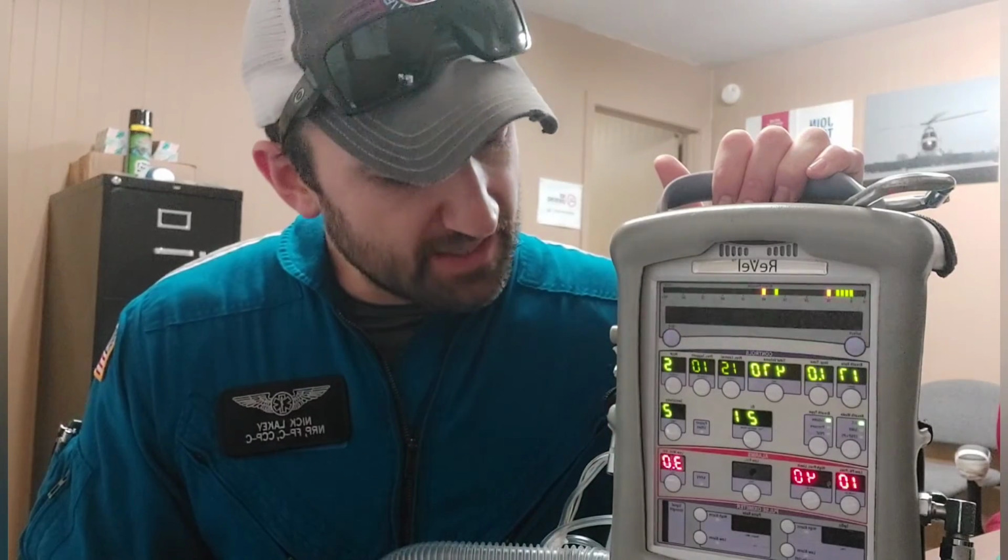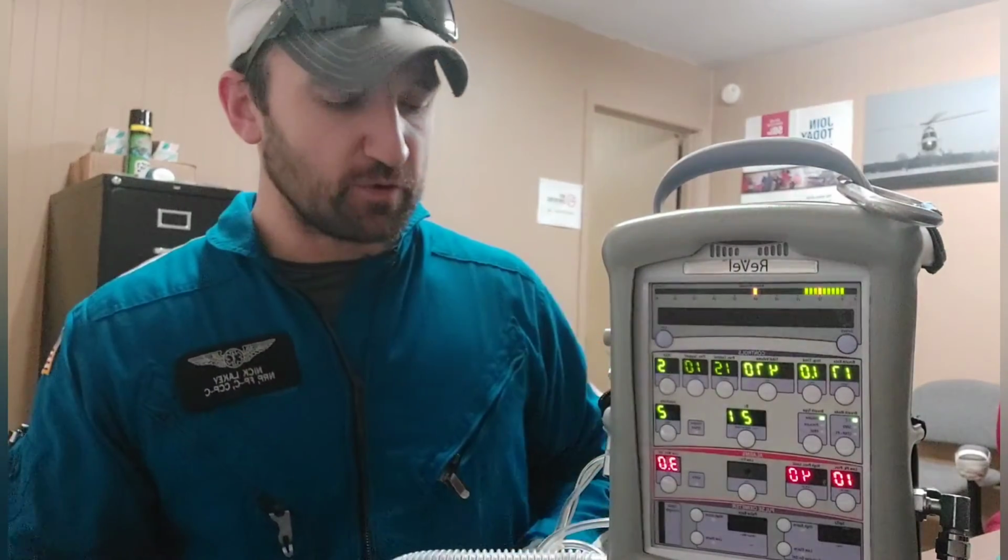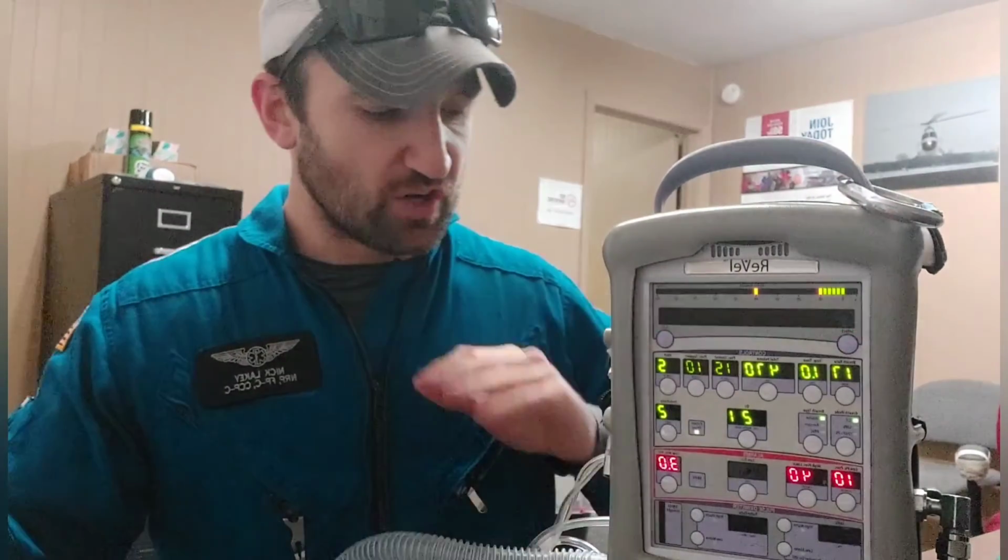So we'd check that circuit, we'd go to the ET tube, we'd check that ET tube depth, we'd go ahead and we would examine whether or not that ET tube's dislodged. We could go ahead and listen to lung sounds again, make sure that it hasn't come out, and we are just going to kind of go down that line there, make sure the patient's not hypotensive, and just check that DOPE pneumonic.